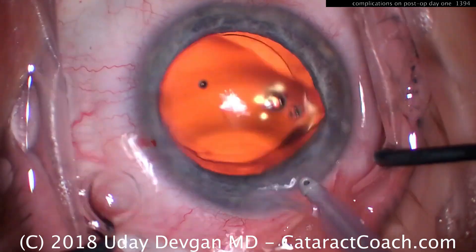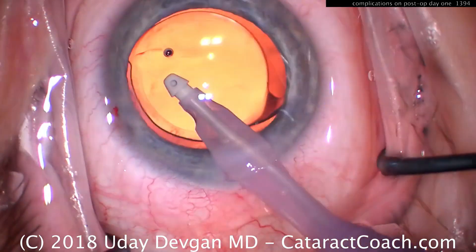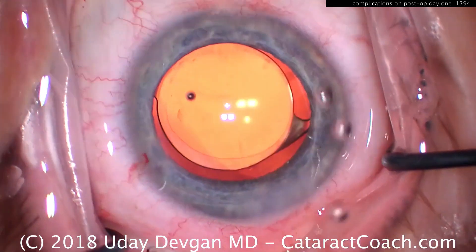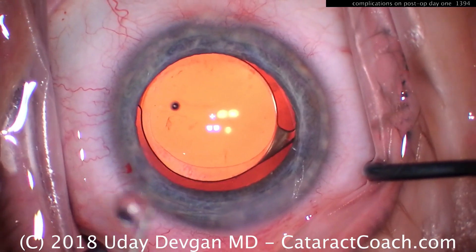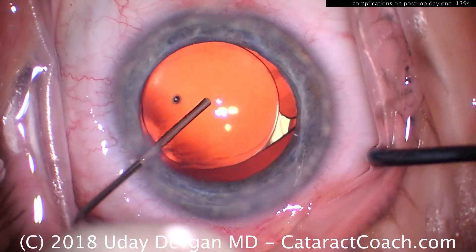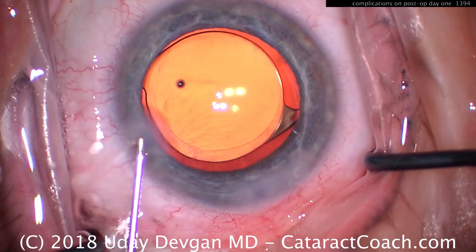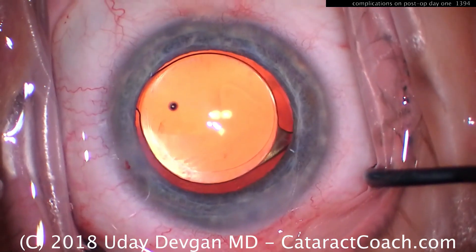At the end of the case, thoroughly remove the viscoelastic and perform the angle sweep. There's still more viscoelastic visible — don't just leave it. That's going to cause high pressure. Use this angle sweep technique again and again; it's a very useful tool at the end of essentially every routine cataract surgery. When you do the angle sweep, it will be clean — beautiful result. Don't leave viscoelastic inside the eye.